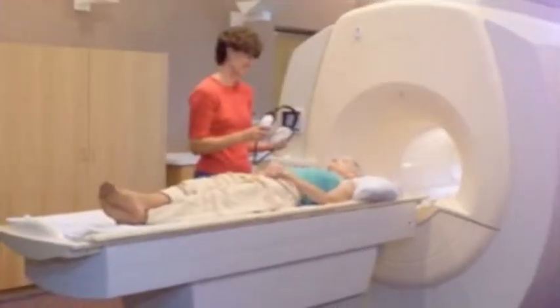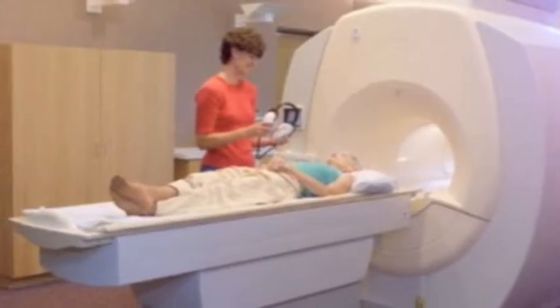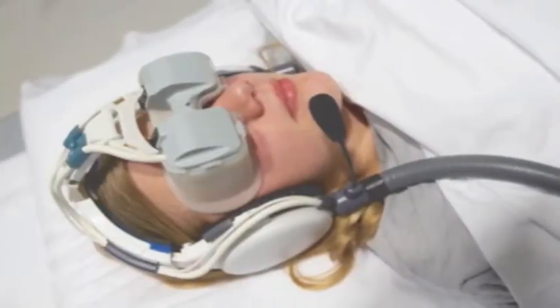One major question: how do you prepare your patients? I know you give them earphones. We get the headphones. 2 options. Some people don't like the headphones on, so we get earplugs or headphones so they can listen to music. There's no metal parts to the headphones, so it's just tubed in by a plastic tube and an amplifier that's sitting outside the actual magnet itself.